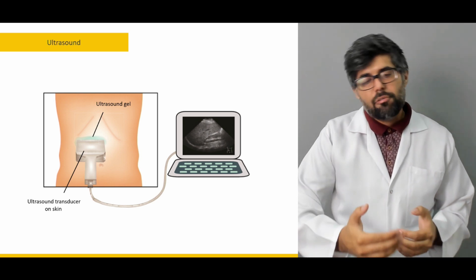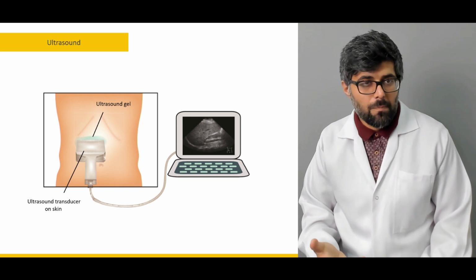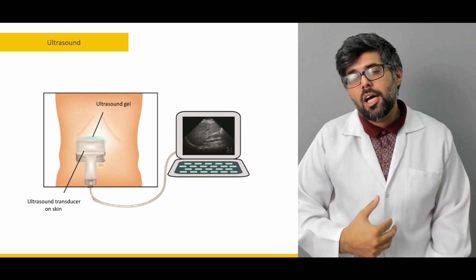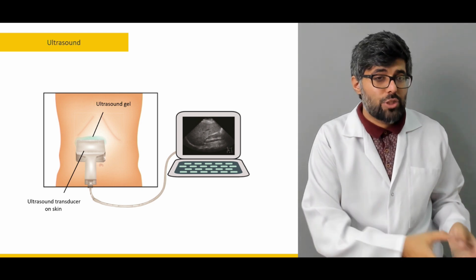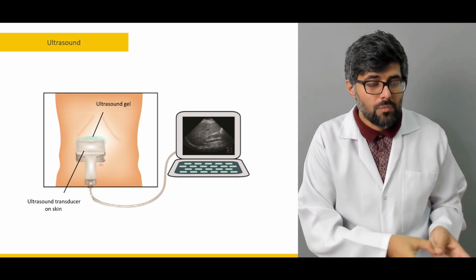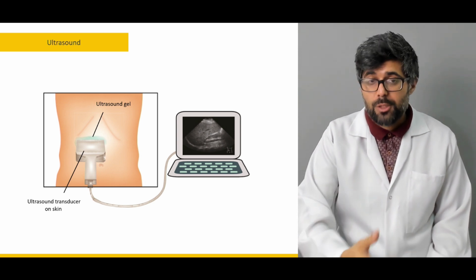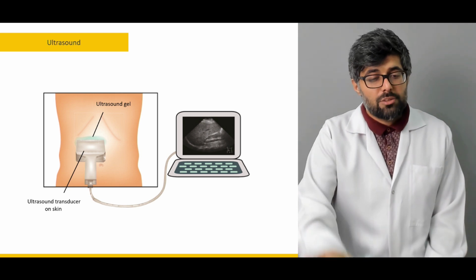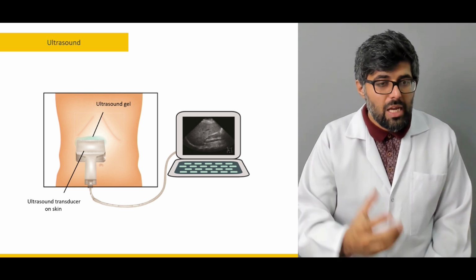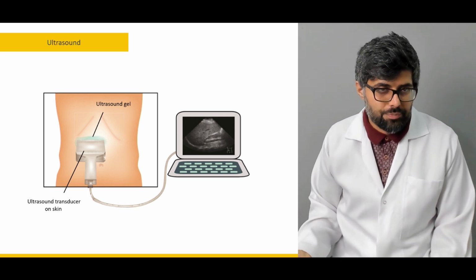Now, how they are reflected back is what is called echogenicity. Each and every type of tissue in our body has a different type of echogenicity. So this echogenicity, or the echo produced by the ultrasonic sound waves in our body, is recorded by the transducers, and that is converted into an image.